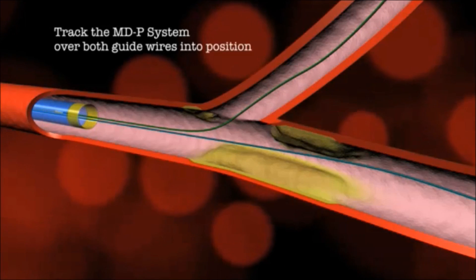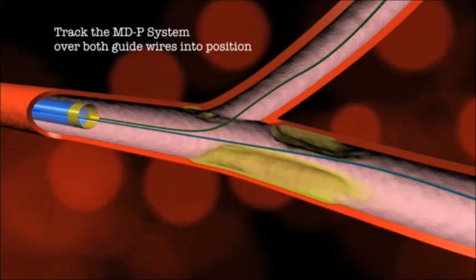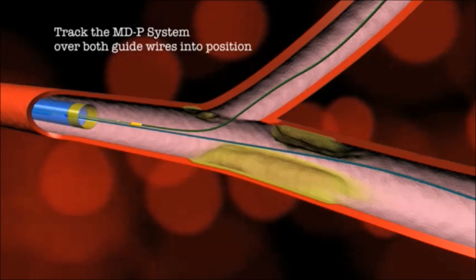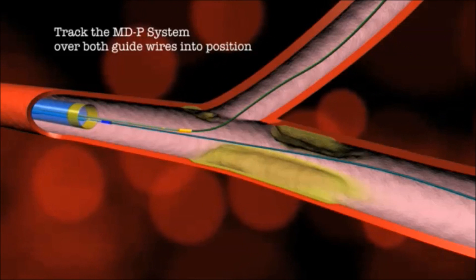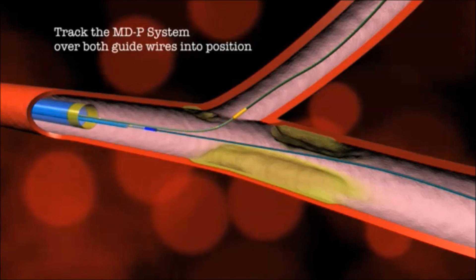The system is advanced over the monorail daughter catheter. Through the over-the-wire lumen of the mother catheter, the second vessel is wired before entering the coronary.